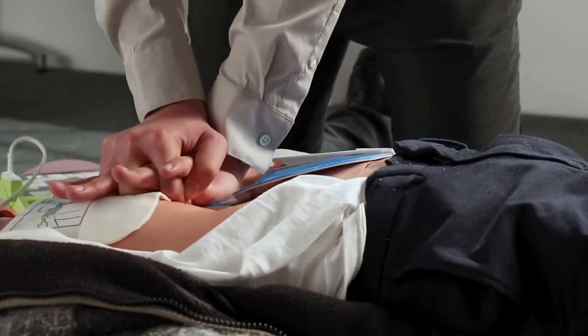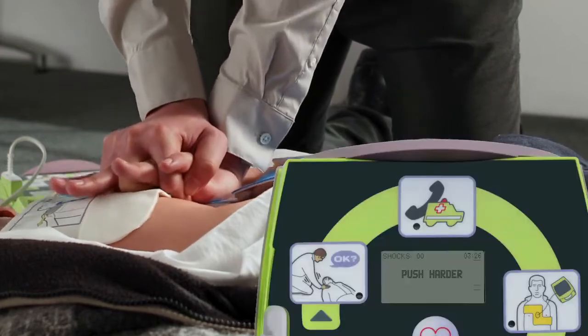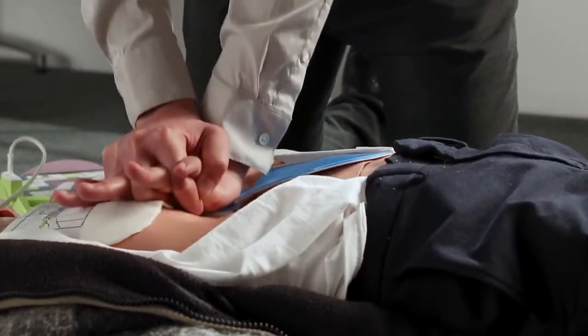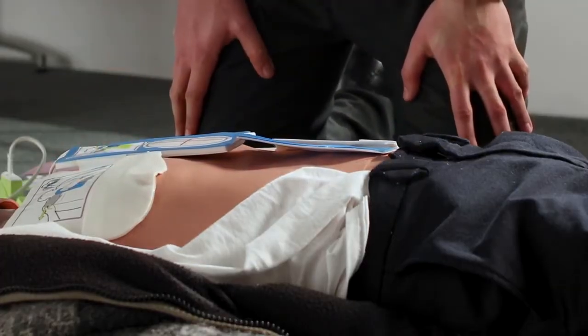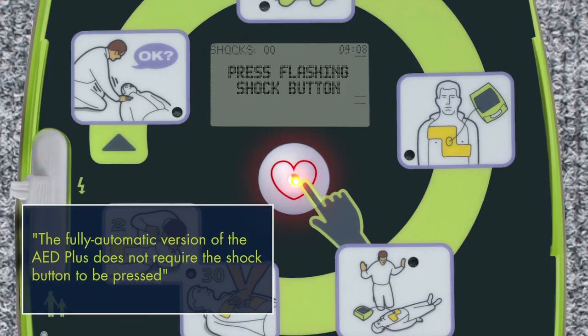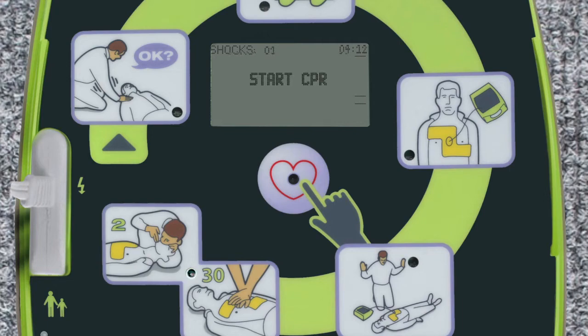CPR is strenuous, and it's not uncommon for rescuers to tire and perform compressions that are too shallow. If they do, the AED Plus will again remind them to push harder. Providing high-quality CPR to a cardiac arrest victim can result in a shockable rhythm on the next analysis. Make certain nobody is touching the patient before pressing the shock button. Press flashing shock button. Shock delivered. Begin CPR immediately after the shock is delivered. Even after a shock has been given, a struggling heart needs high-quality CPR to help it recover to a normal rhythm.